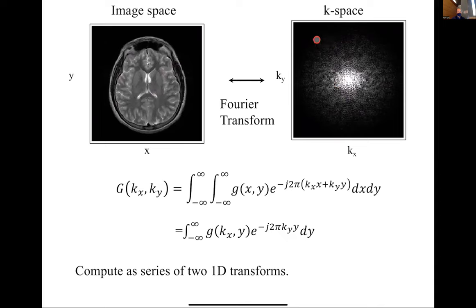But the idea is, instead of having to acquire all this data, can we acquire less data? Because the less data we have to acquire, the faster we can go. And also, as you saw in some of your homework, sometimes the data has problems with it, right? There might be some spikes in the data that introduce artifacts. Can we be smarter and say, hey, if I see an artifact, it's probably not real. How can I get rid of it? That's where deep learning comes in, in terms of getting rid of artifacts and also being able to go faster.